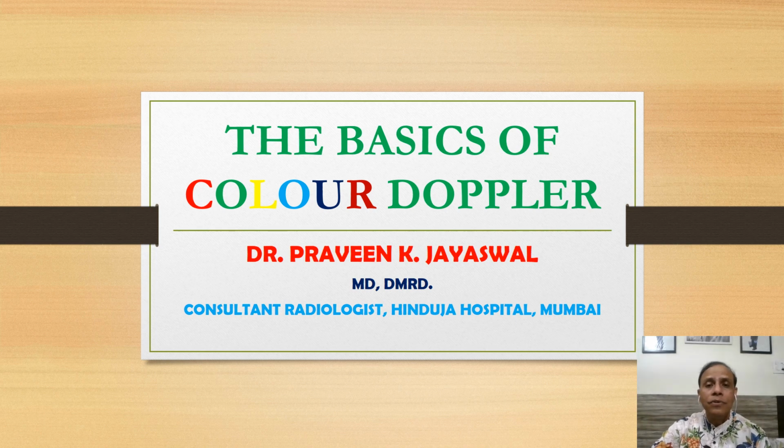In today's video, we'll discuss the basics of color Doppler for the students and freshers in radiology, how this Doppler is done, what are the basics, the machinery, the knobbing, and the indications and the minute details.